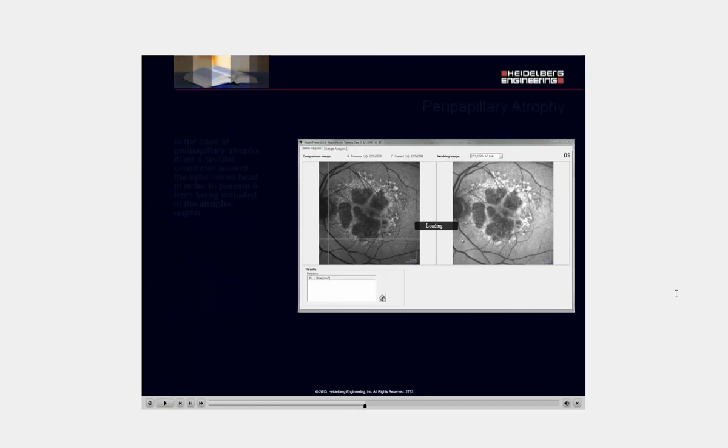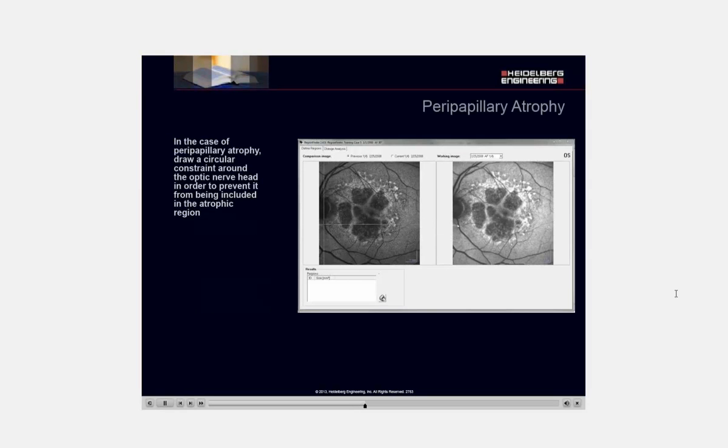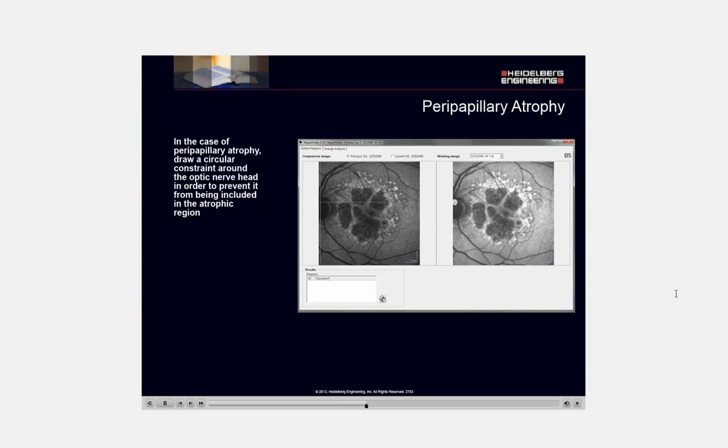In the case of peripapillary atrophy, draw a circular constraint around the optic nerve head in order to prevent it from being included in the atrophic region.